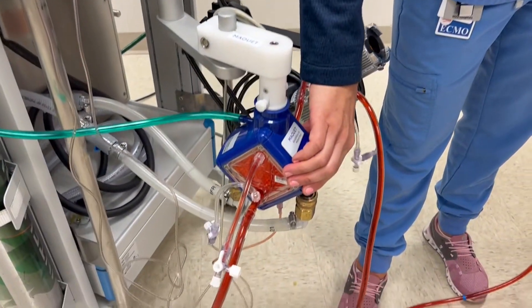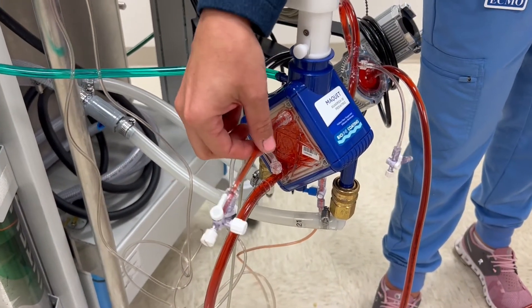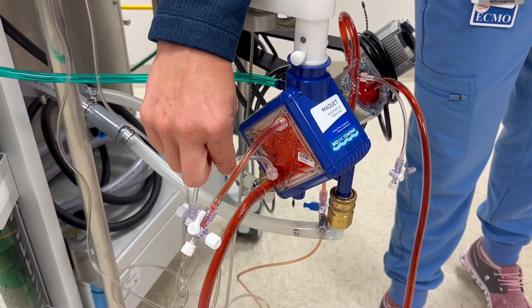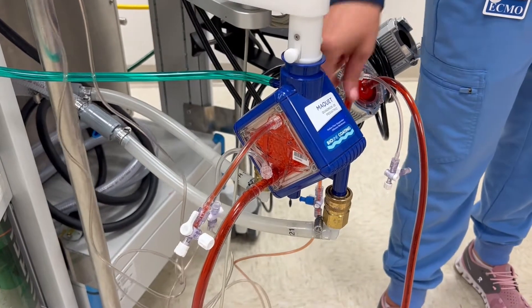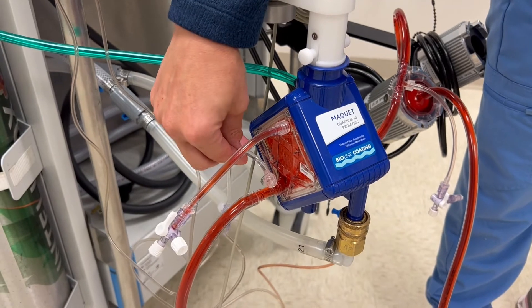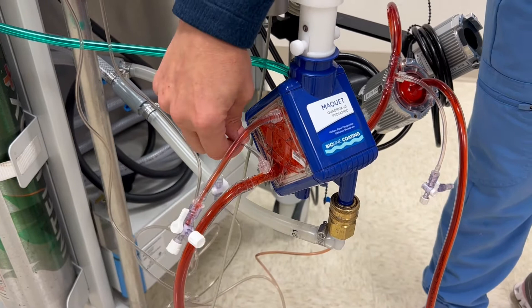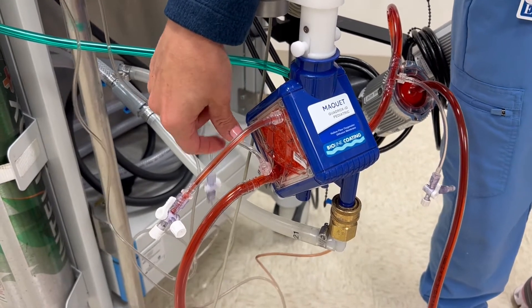On the backside or arterial face of the oxygenator, we have a pigtail at the top if we need to have flow go through, and we have our second pressure line. The first and second pressure lines give us a delta P that lets us know what the pressure is internally in the oxygenator, allowing us to know if there's any clot or anything we need to be cognizant of.